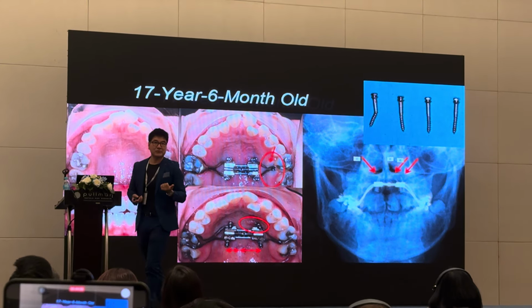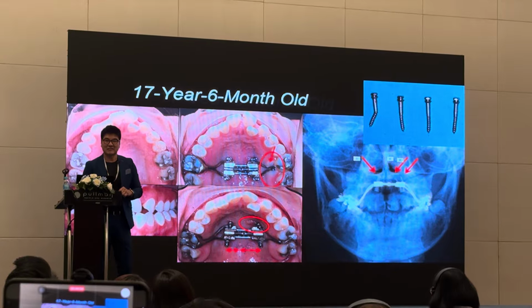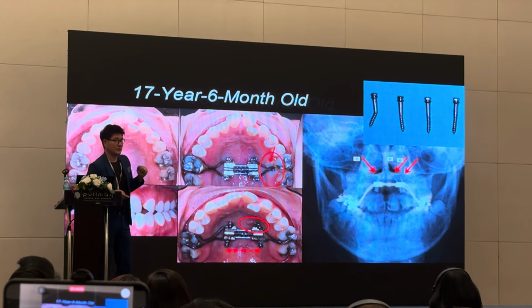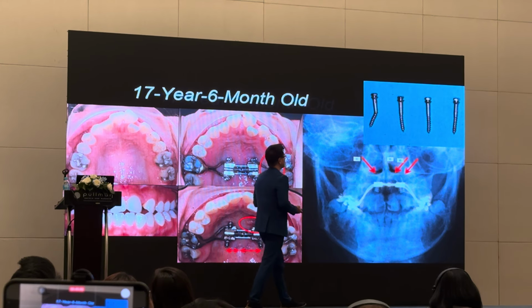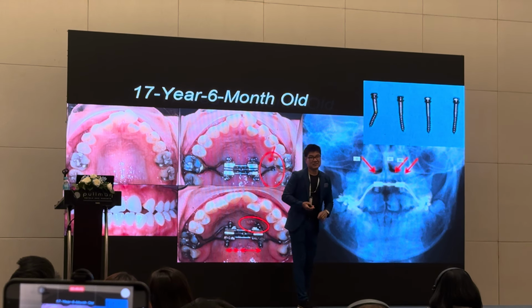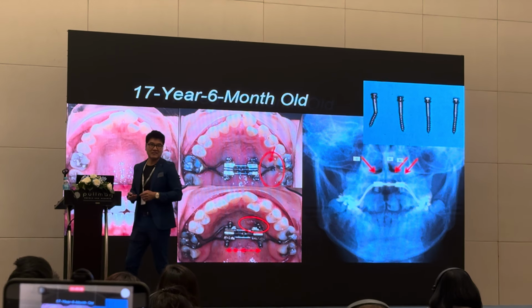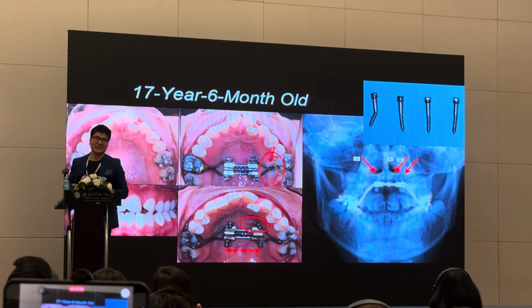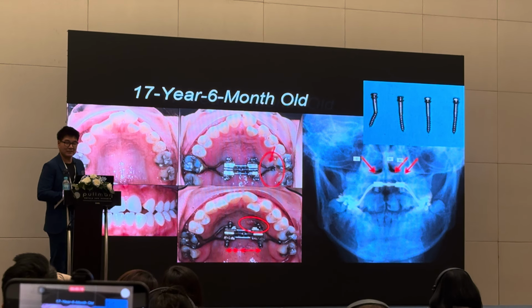These are titanium screws. You know how much force it requires to bend the titanium? That much strain goes to these screws. And I'm very lucky because this one didn't break. What if it broke? How are you going to retrieve this? This is very close to the nasal cavity, right? Not a good situation. So make sure you have bicortical engagement.